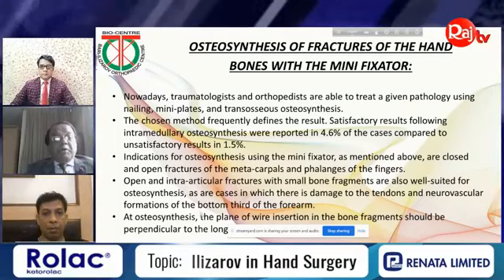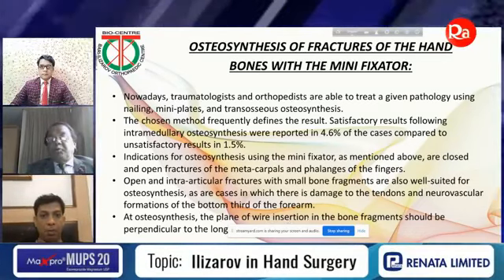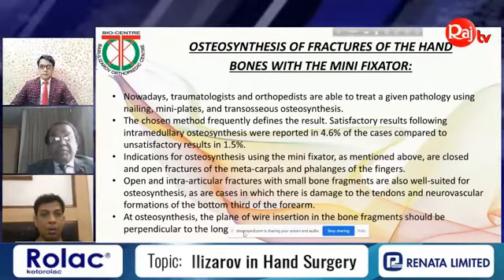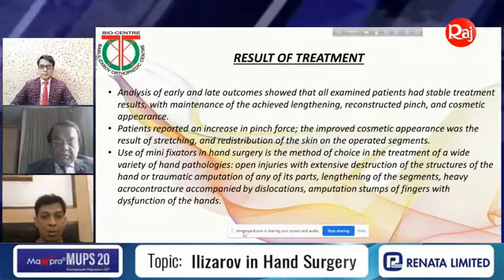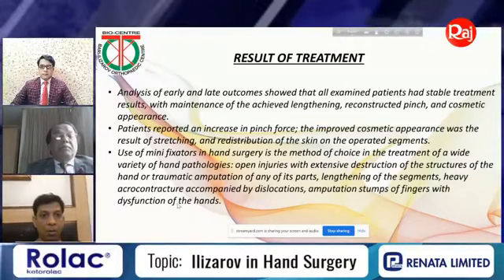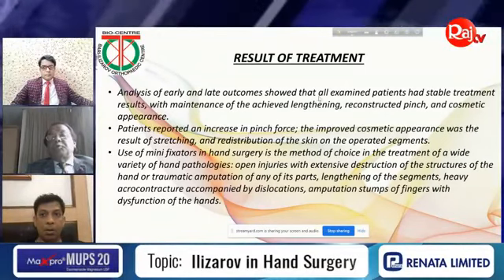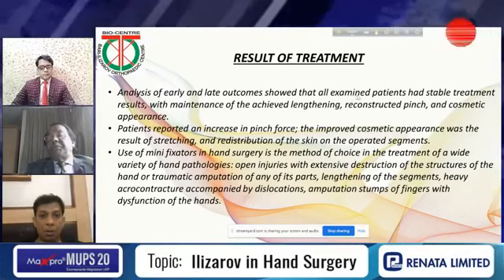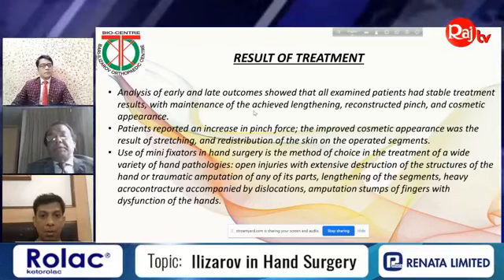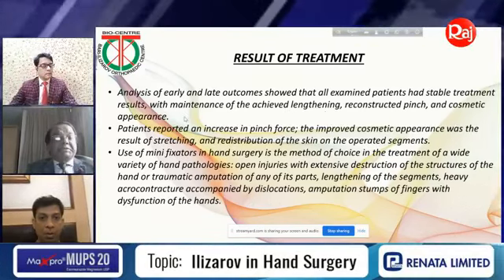Whenever we are thinking about osteosynthesis, the plane of the wire insertion is very important. The wires should be perpendicular to the long bones, and this is very important. And in our cases, when we talk about the results of treatment, if we analyze our early and late outcomes, all the patients we examined showed stable treatment results with maintenance of the achieved lengthening, reconstructive pinch, and cosmetic appearance.